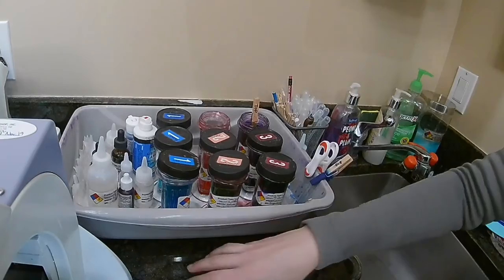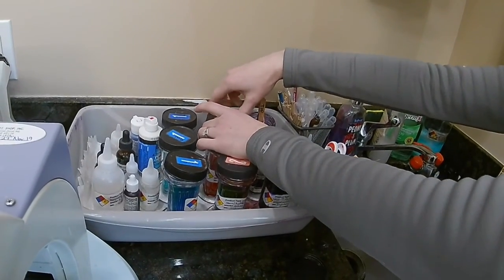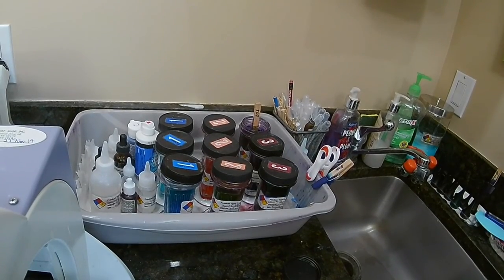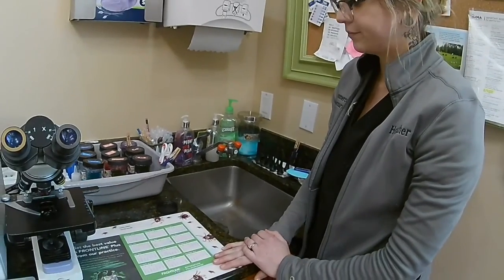Alright, we're going to switch on over. Another 15 to 30 seconds on that one. And then I will be rinsing. From there I'm going to let it air dry again, and then we'll start moving on to the microscope.